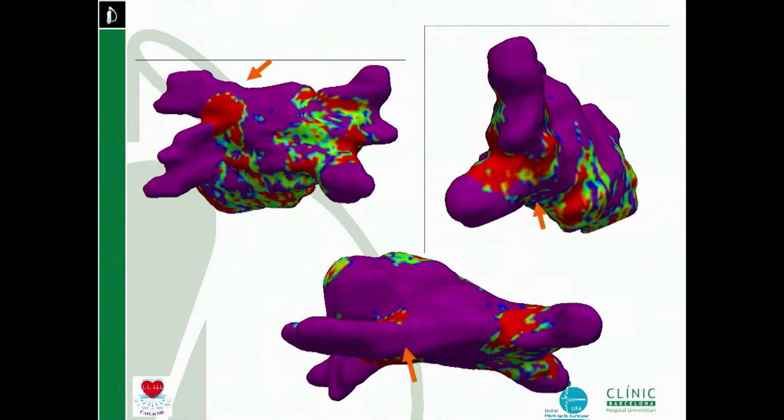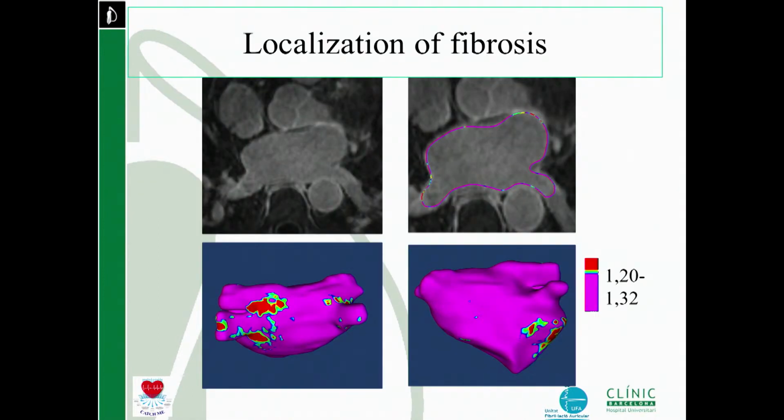What you see is that you can really identify areas where you have gaps. So it really helps in directing the re-ablation procedures, because it's very clear what you have done and what you have not done, and you can go back and just burn there to complete the lesions that you did in your first step.